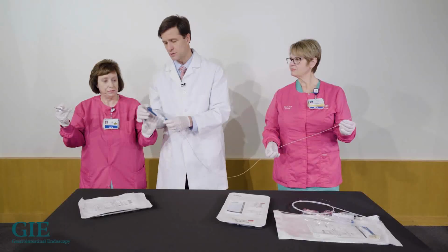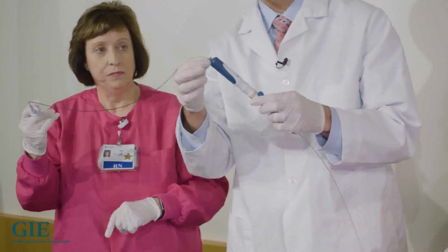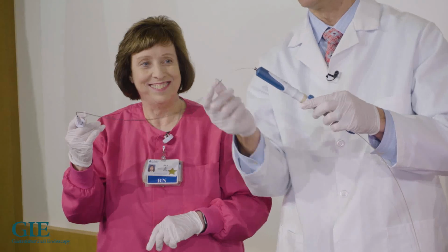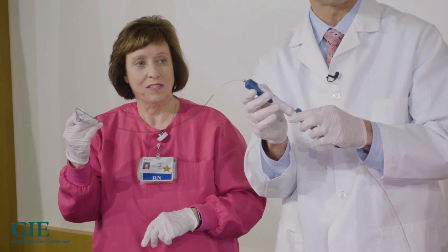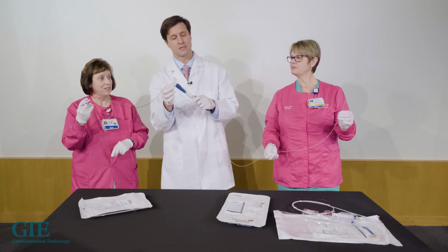This part where it's open here, this black sheath on these through-the-needle forceps is not all the way hubbed to your FNA needle. There's a distance of about, using my measurement tool, about 4 centimeters. So that's the distance you're going to have, 4 to 5 centimeters, before the forceps actually, let me bring it back just a little bit, maybe 5 centimeters before the forceps come out through your needle.